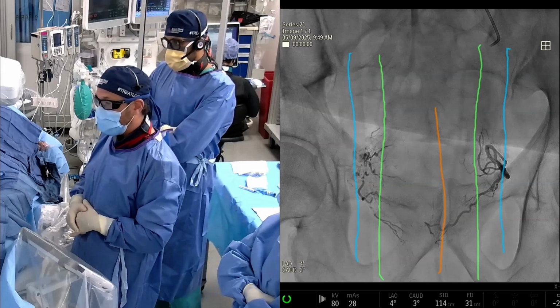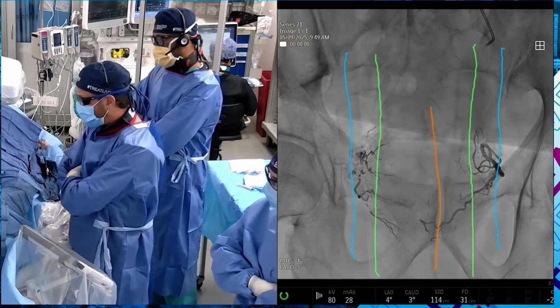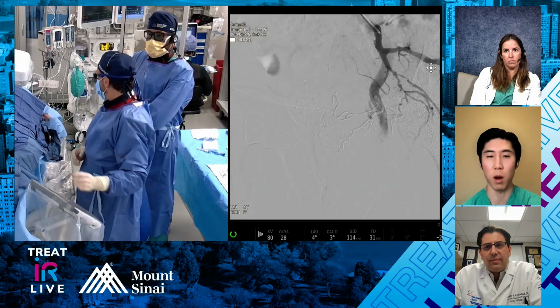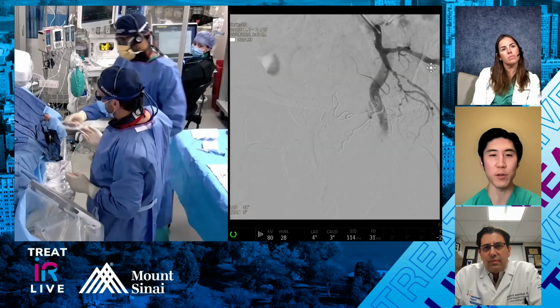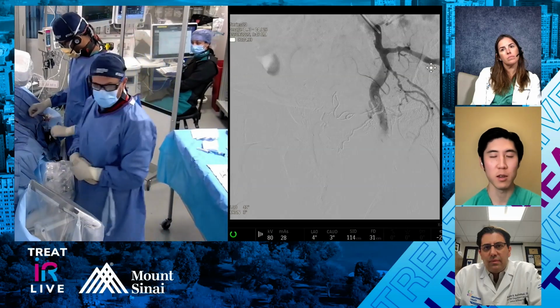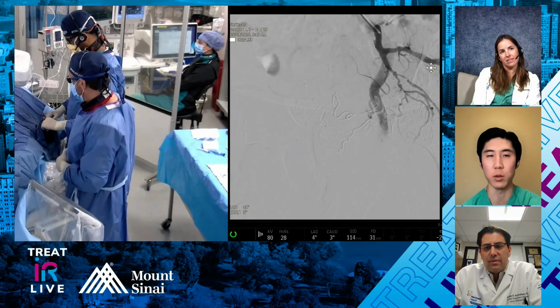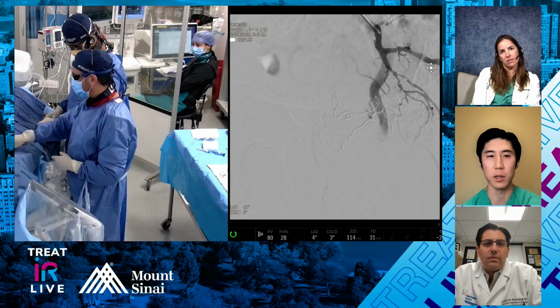What do you guys think? What are you typically getting with fluoroscopy times and dose with glue? Yeah, it's much faster. I mean, 10 minutes is for standard anatomy. I think 10 minutes is a great time. My personal record I've shared with Aaron is 6 minutes, but yeah, it's much quicker than having to sit there and watch and do the particles, and I think most people can understand that concept.